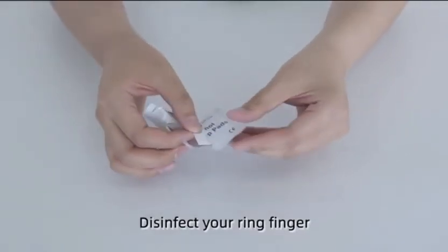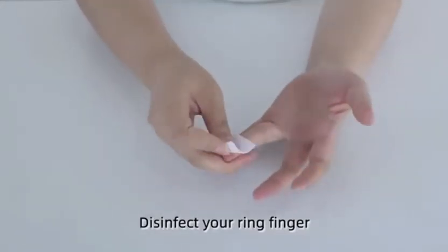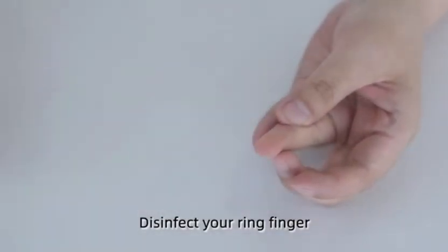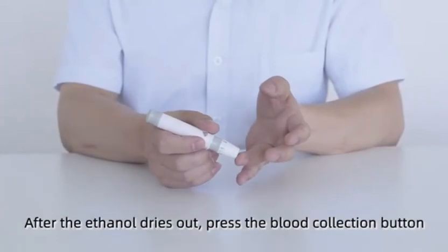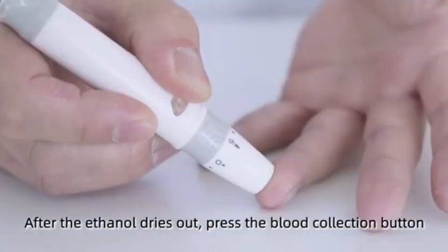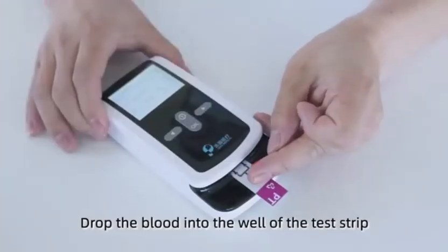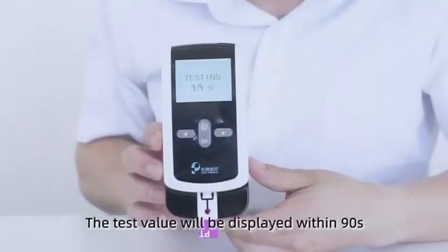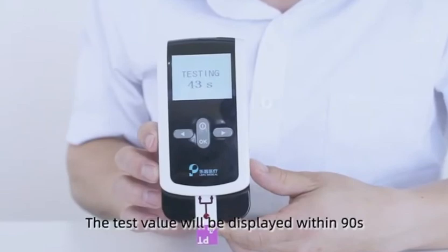Disinfect your ring finger. After the ethanol dries out, press the blood collection button. Drop the blood into the well of the test strip. The test value will be displayed within 90 seconds.